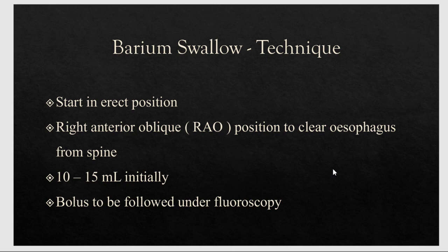We give 10 to 15 ml of barium suspension initially to the patient in the form of a bolus, and this bolus is to be followed under fluoroscopy. Now fluoroscopy is again a technique of imaging the tubular organs along with the contrast. It uses X-rays in high intensity, and this fluoroscopy visualization is required for barium swallow, right?